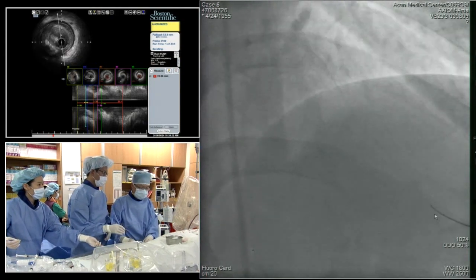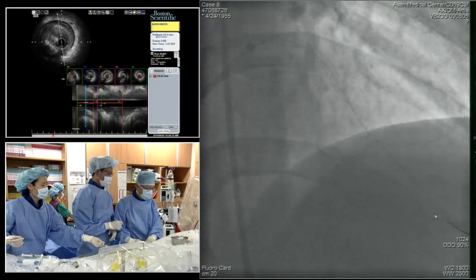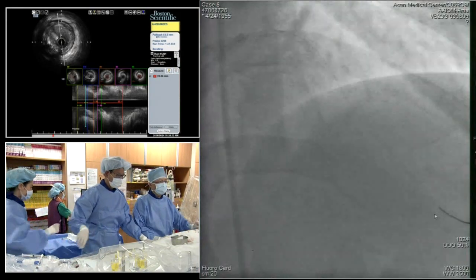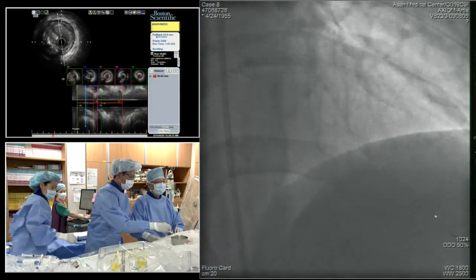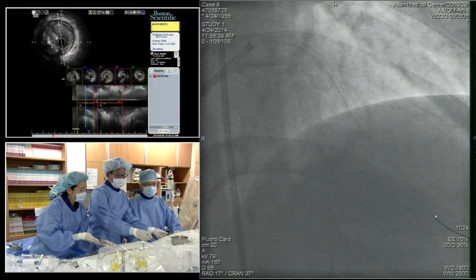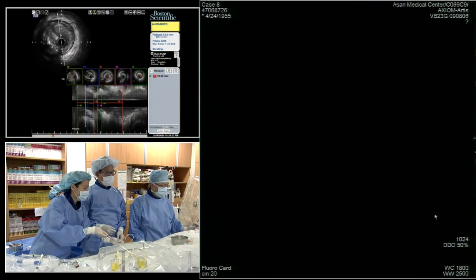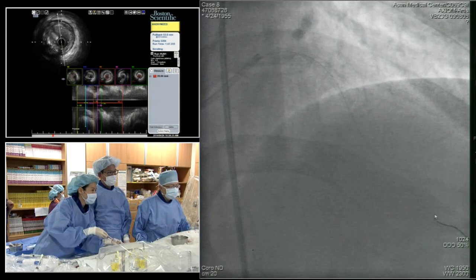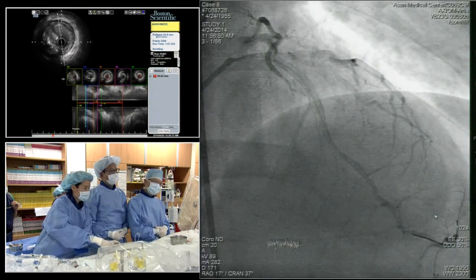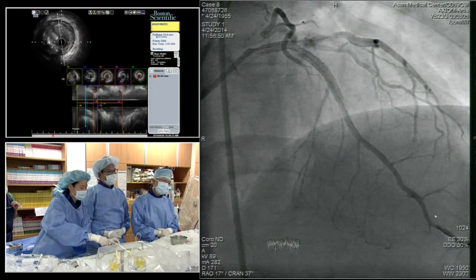The difference also is that Alan had a good point with the occluded right. You don't want to leave it up very long, but generally what I would do is leave the balloon up for a full 30 seconds. In this case, depending upon blood pressure and other things, I might have gone down sooner, and then a second inflation is very reasonable. You just don't get full stent expansion in a few seconds. Looks good. Let's do a spider.